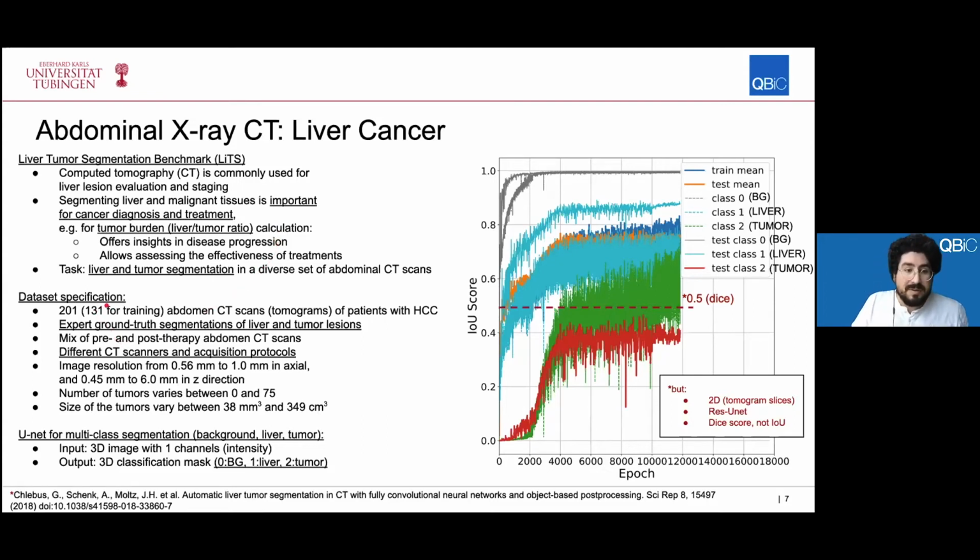Automatic segmentation is not easy, since there are different CT scanners and acquisition protocols, intensity changes, varying contrast levels, and many variables that make automatic segmentation a very challenging task for this modality. And so we approach the problem in the same way.